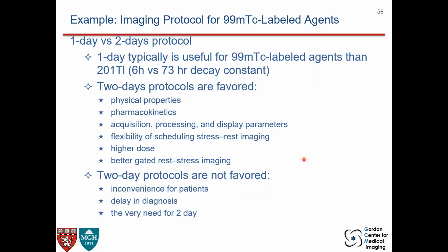protocol. 1 day, obviously, it's easier to implement in a way because your hospital utilization is less, and imaging time, within the same day, when your patient comes over, you can scan the patient for rest and stress in the same day, and less complication.